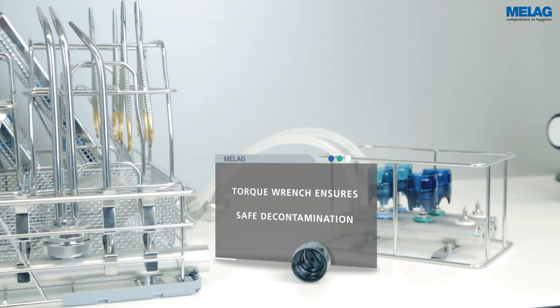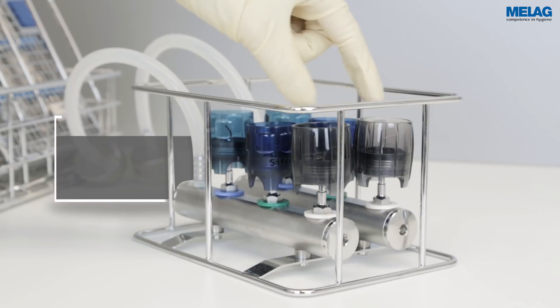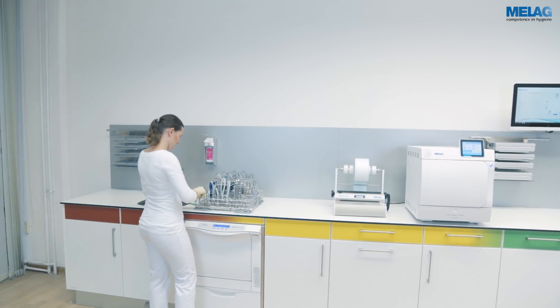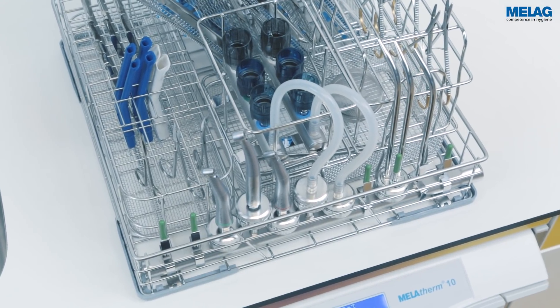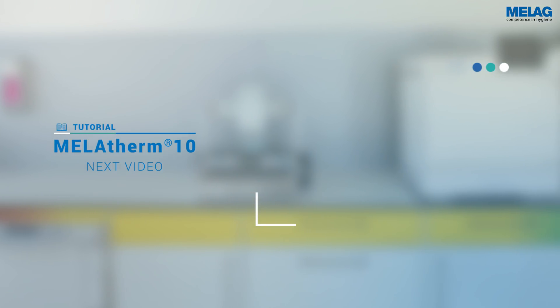The injector basket Flex 1 provides a space-saving solution for the decontamination of six ultrasonic scaler tips. The coloured marking facilitates the assignment of the ultrasonic scaler tips. To optimise water distribution in the injector rail, close non-used connections with the silicon closure tabs which are included in the scope of delivery.